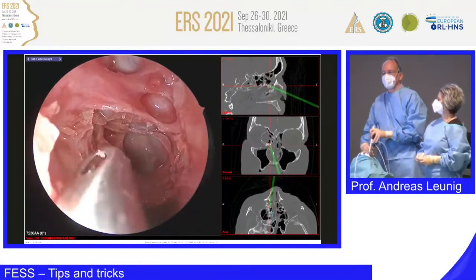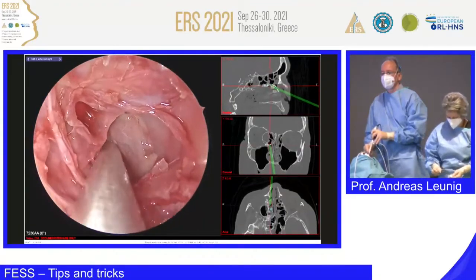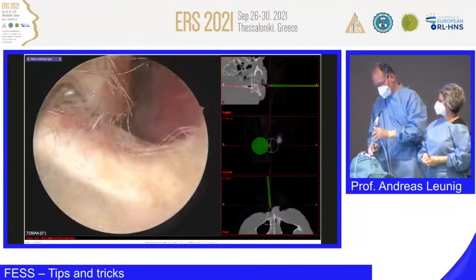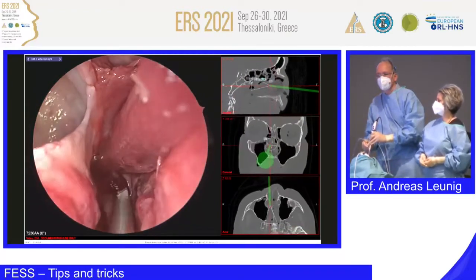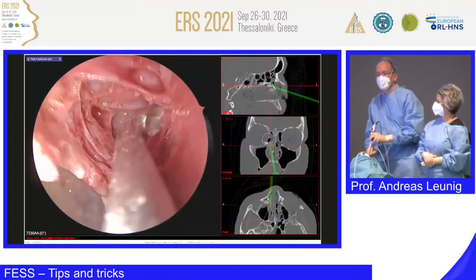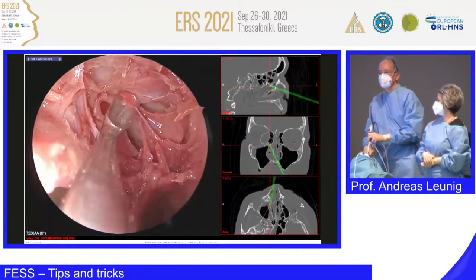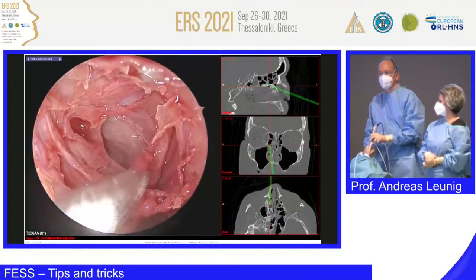Okay, so let's go in. No, I don't see it. Once again, I'm cleaning a little bit of these bony lamellas. I could use navigation as well, but I want to see if I'm getting inside. So there must be a space here. Can you see it? I try to replace the mucosa here. Oh yes, maybe. This is the superior turbinate here, yeah?